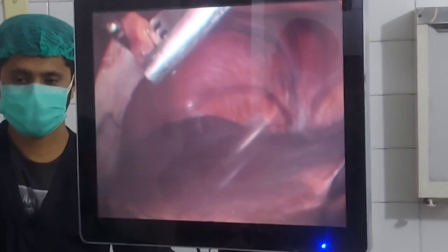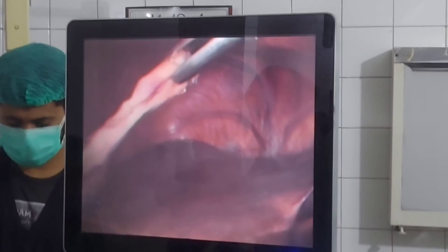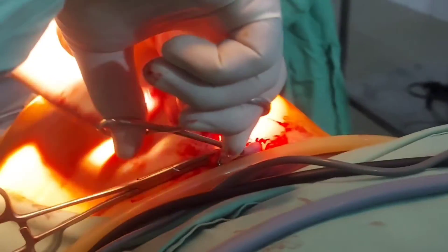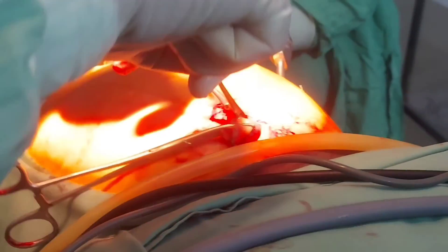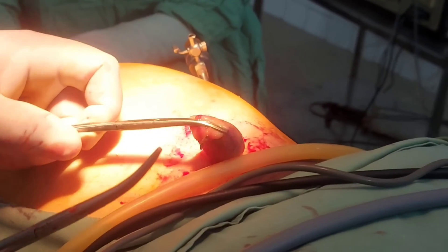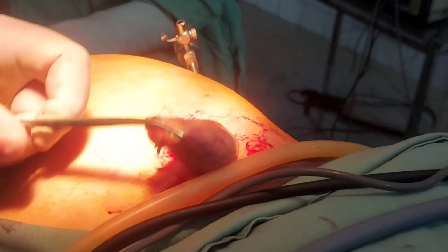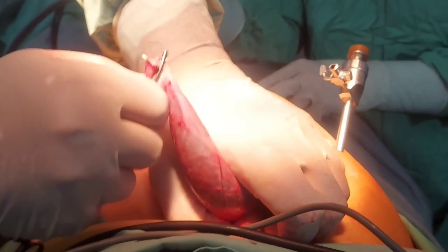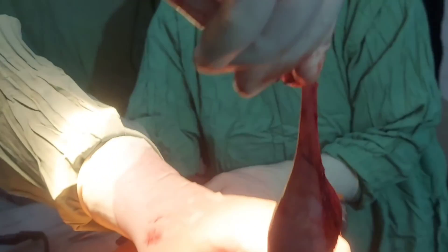The gallbladder is retrieved by grasping it with crocodile forceps and extracting it through the 10 millimeter port site, either from the sub-xiphoid site or through the camera port. The gallbladder is being removed from the sub-xiphoid site. If the gallbladder is difficult to extract, Mayo scissors or artery clamps are used to extend or widen the incision site; a blade can also be used to cut the skin or subcutaneous tissue to widen the incision.